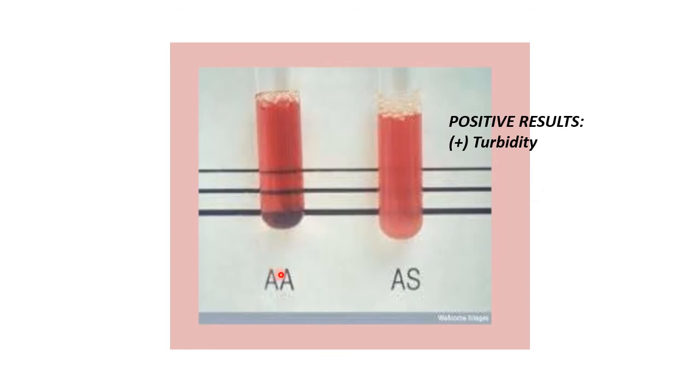Halimbawa, ito, it contains the normal adult hemoglobin, no? Complete lysis. So, you can see through and through yung paper do sa background. In contrast with the sickle cell, hemoglobin S, which is resistant to lysis. So, very turbid. Hindi mo makikita yung background paper.